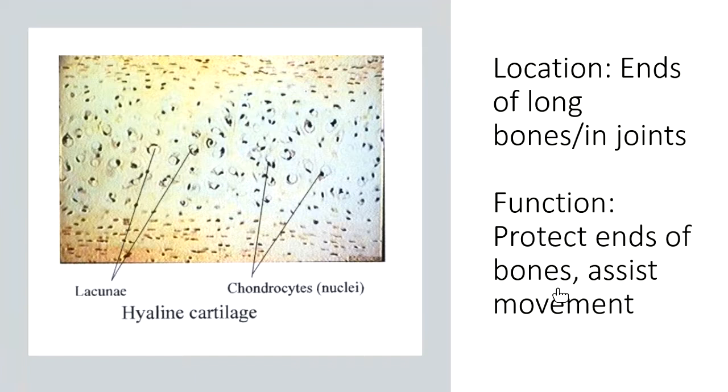Also, we get to chapter 7, the bone and joint chapter. We look at this: chondrocytes or chondroblasts, and these are actually the chondrocytes, and so these little dots again are the cells.